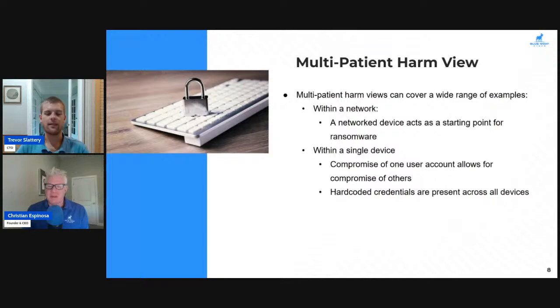One of the first medical devices I've worked on, I think this was in 2014, had this exact problem, where the field technicians had a hard-coded password in order to get into the device. And one of them posted it on the internet so he would have easy access to it, but it was openly accessible, and we were able to find that. So basically, somebody could get into every single device from that manufacturer using that password in maintenance mode.